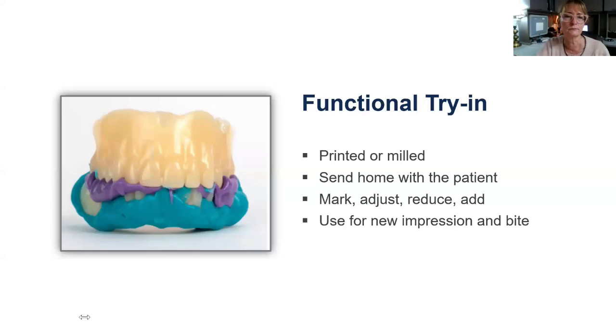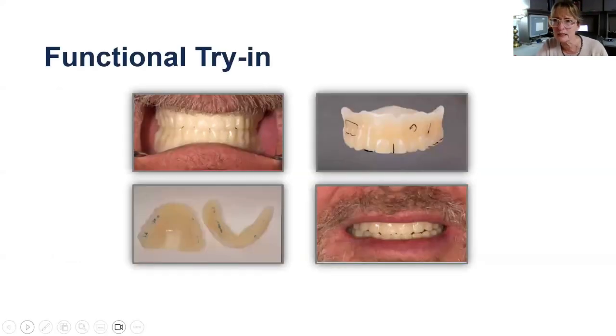Great questions. And we do print our dentures and our try-ins versus milled. That's an important difference for people to understand. Most labs that I have interacted with choose one or the other. Often they don't do both. And there are some labs out there that preferred a milled denture product. And at National Dentex, we have opted to go with a printed solution.